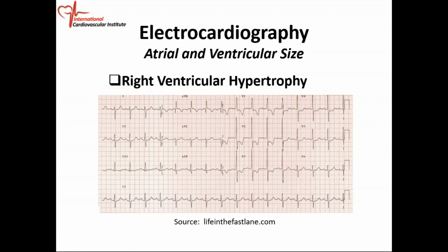All right, so if you don't have your cheat sheet to follow, I tell you, always walk with it. The most isoelectric limb lead is lead 2. Perpendicular to lead 2 is AVL. AVL is negative, however. Positive AVL is minus 30. So negative AVL is plus 150. So that's right axis deviation.